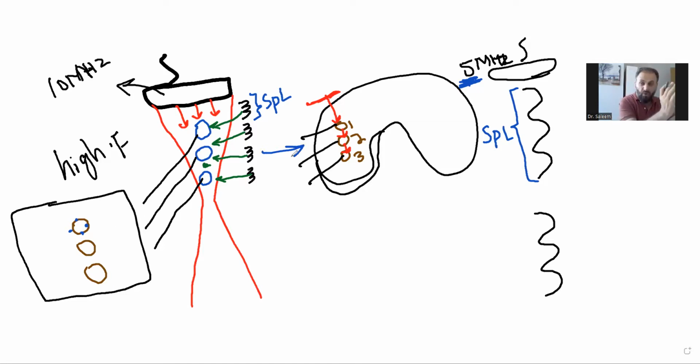So your report and the patient's anatomy, whatever is in the thyroid tissue, the masses, will exactly match. This is one of the reasons we have to use this high frequency transducer for the superficial structures. Plus, if I want to see something very detailed, I have to use a high frequency transducer.